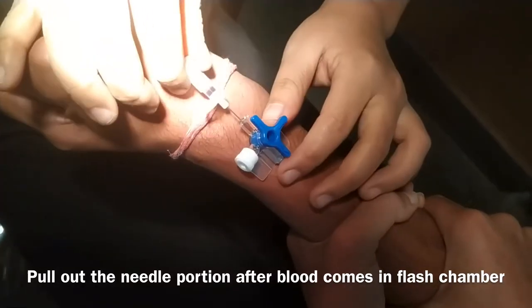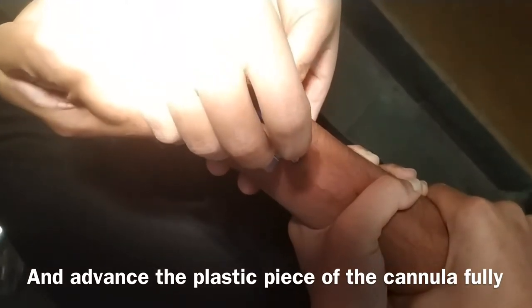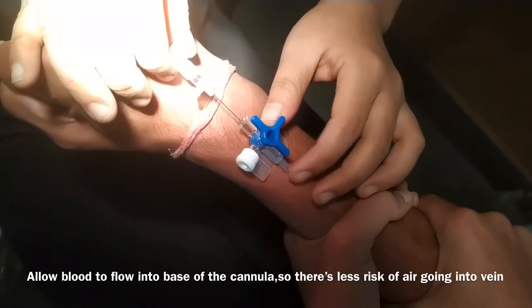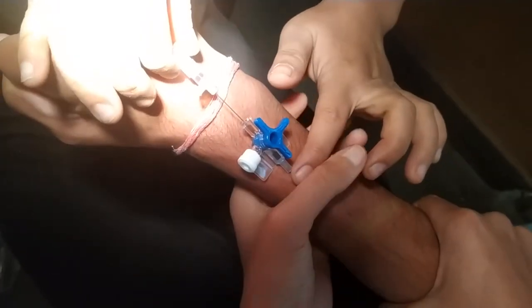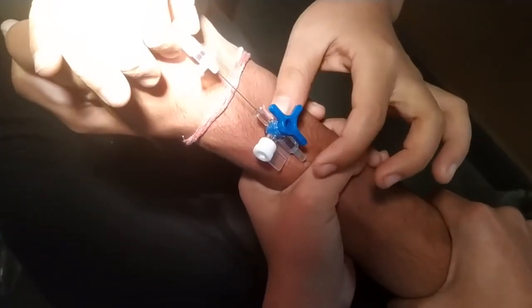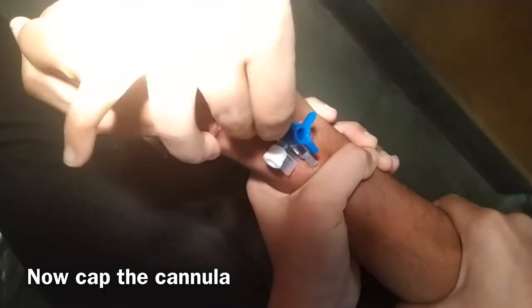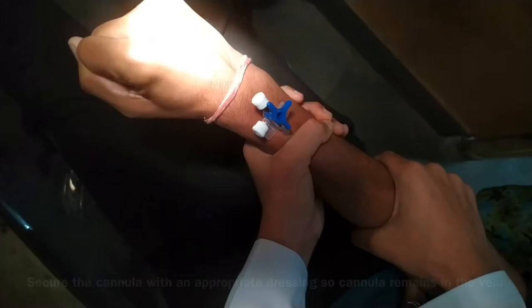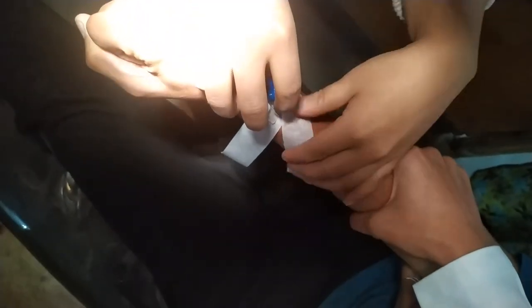Pull out the needle portion. You can see blood in the flush chamber halfway. Since the vein has been punctured, advance the plastic piece of the cannula fully inside. You can see blood in the flush chamber. Now cap the cannula — close it with a cap — and secure the cannula with an appropriate dressing so the cannula remains in the vein.